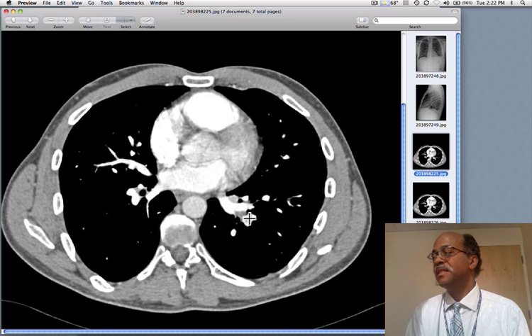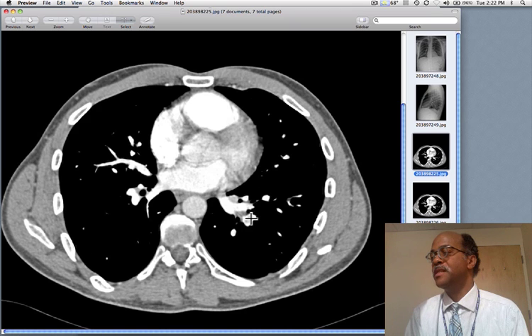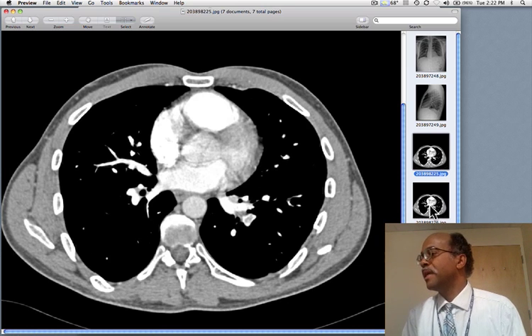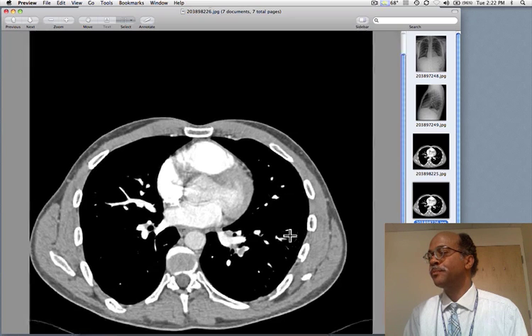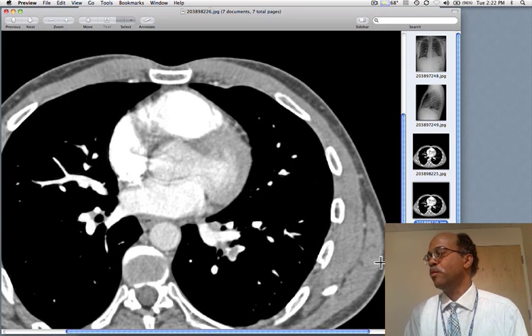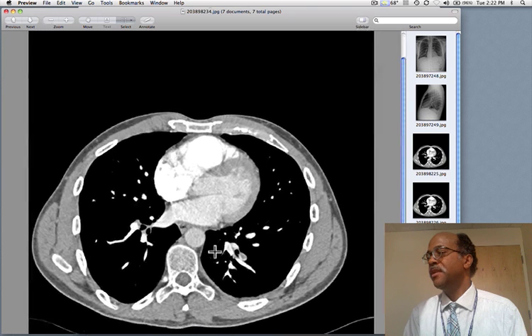We can see that there are filling defects. Here is a nice example of an embolus in a descending pulmonary artery as compared to the other side. If we continue down, again we can see the pulmonary embolus. Here are normal vessels. We continue and we see it again.